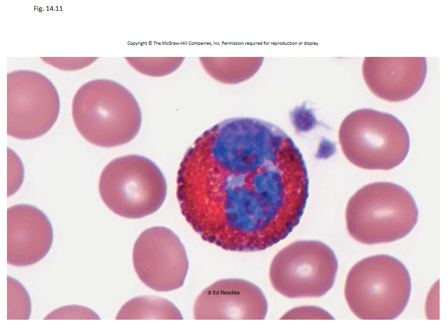So when I was in school, see, these have very red granules. The eosinophil has really, really bright red granules. So I could remember that the red granules were eosinophils because I grew up as a Catholic or a Christian, and I remember being taught that the blood of Jesus covered my sins. So it's called an eosinophil. So I could remember that the red granules in the blood was the eosinophil, to try and tie those two together. If that works for you, great. If it doesn't, no big deal. I'm not trying to push anything on you, but just an easy way to remember that.